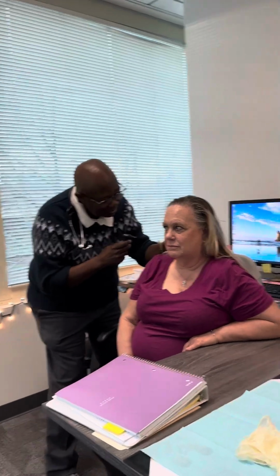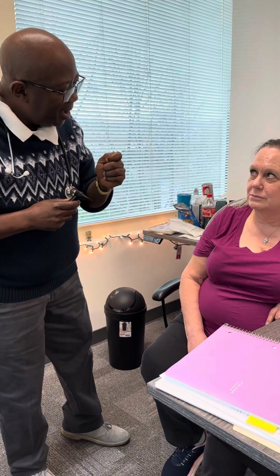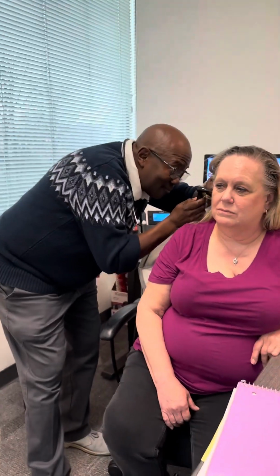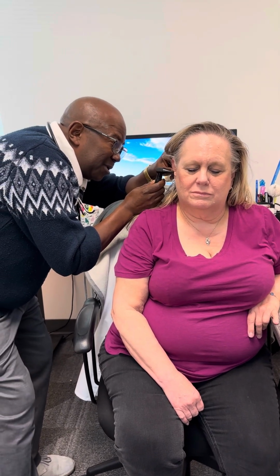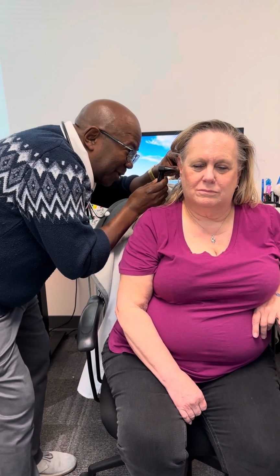And when I'm looking into the eardrum, I will pull back and up. If it is a child, I will pull back and down. And I'm checking for any inflammation in here. I'm checking if there's any redness. I'm checking for any wax accumulations. And I'm checking if any damage is done in the eardrum area, which I see there is none.